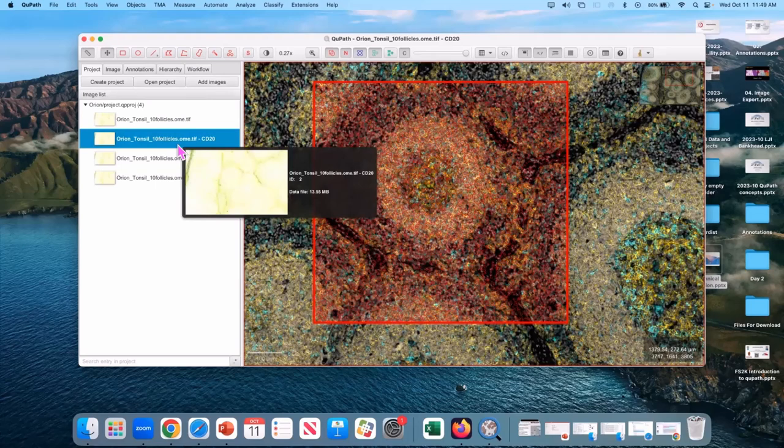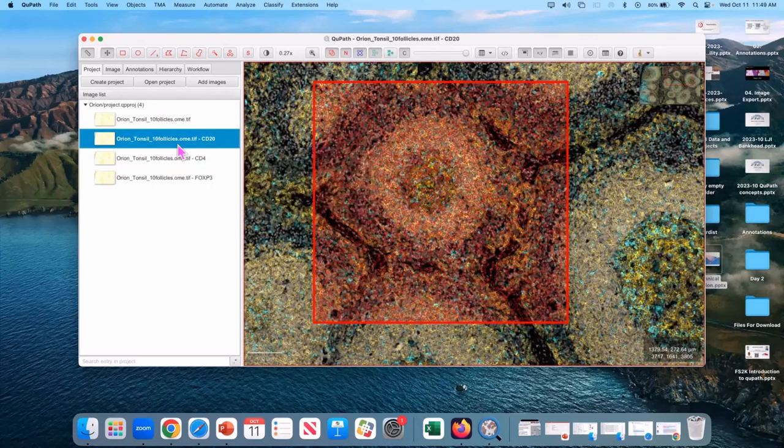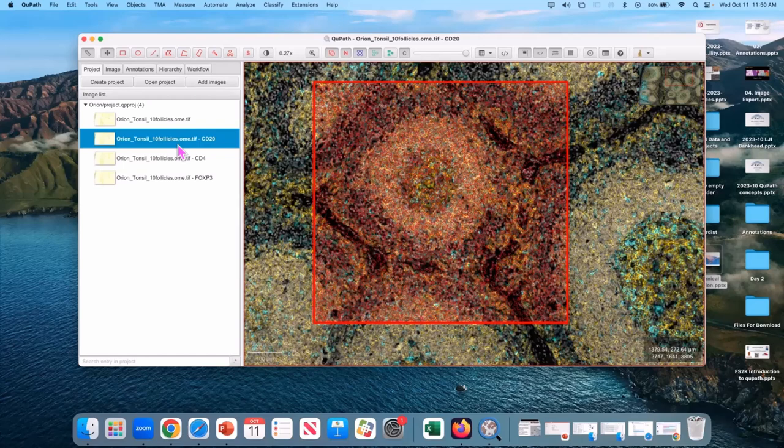And then you can open up the CD20 and it looks the same. All of the channels are still there. The idea is this is just a neat way of organizing your project such that in this image I'm going to deal with my CD20 classifier. In the next one, I'm going to deal with my CD4 classifier. And then I'm going to go back to my original and run it all and have this all saved and labeled and everything.